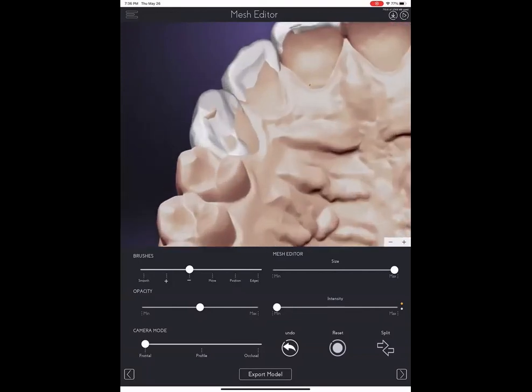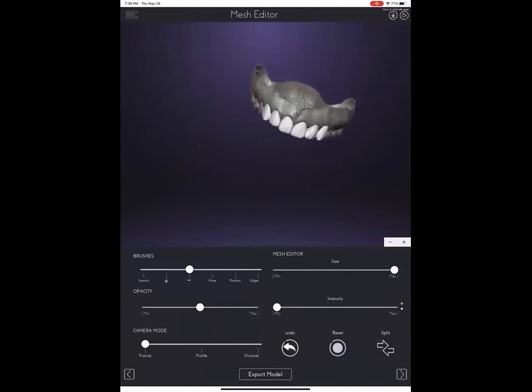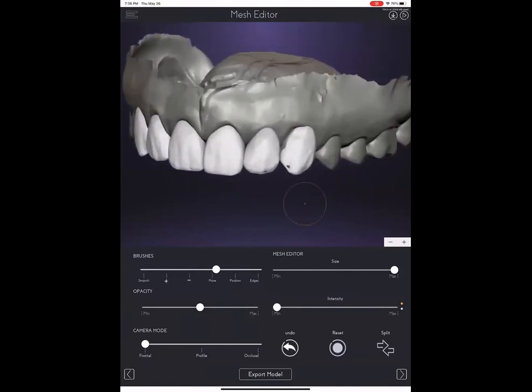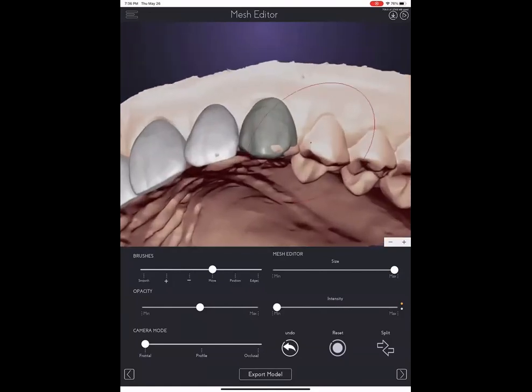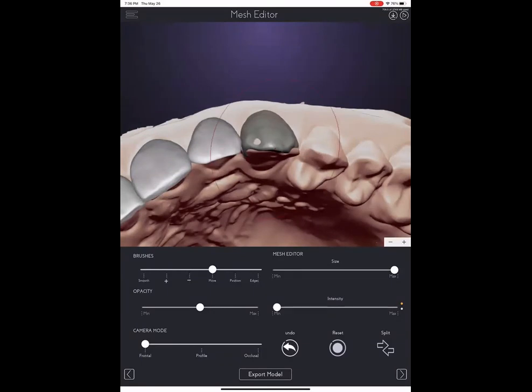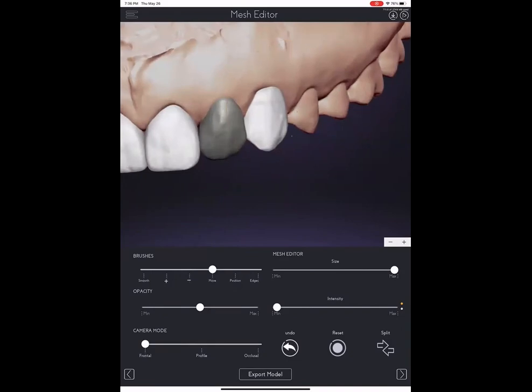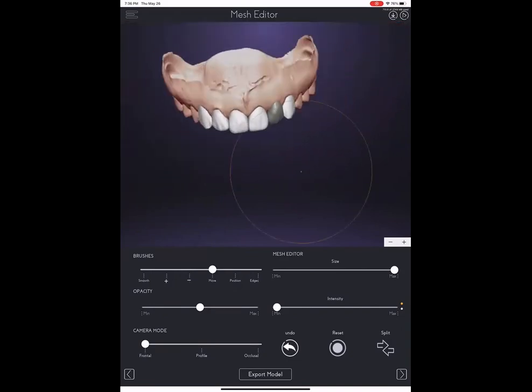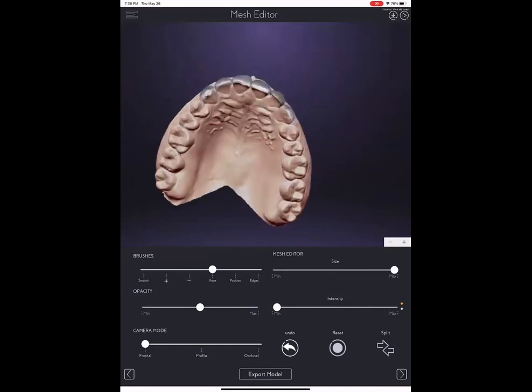Our philosophy here is to always involve the patient in the process. Although the patient already agreed on a smile simulation, when you place this type of mock-up in your patient's mouth, the reaction is totally different because they're literally seeing, they're feeling the dental wax-up in their mouth. And that's kind of like the final check prior to you spending a lot of money and a lot of effort towards the final restoration. Okay, so done. We are done.